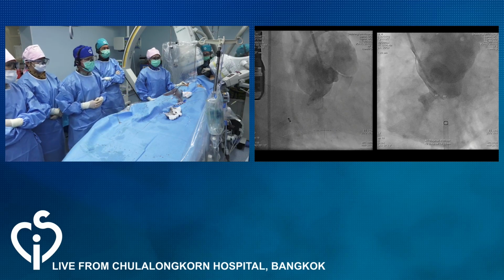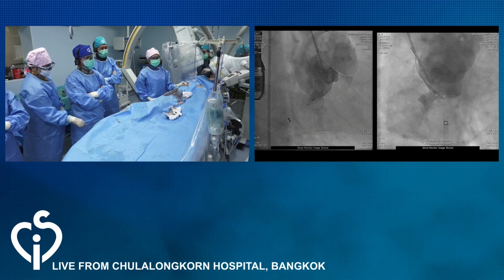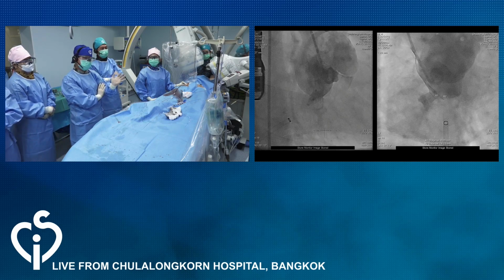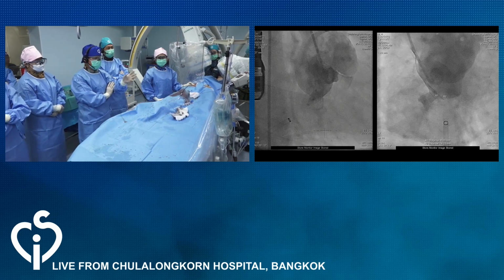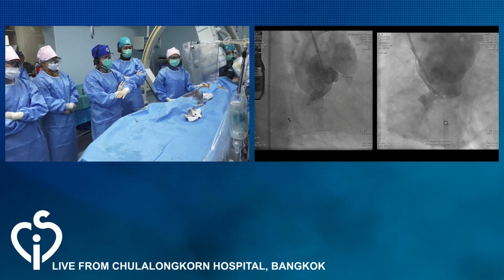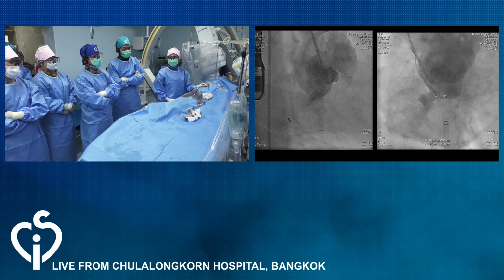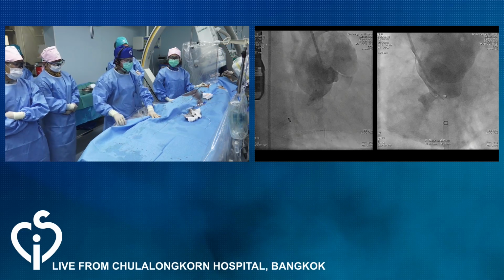It's 6 something. 6.1. Okay. And you can see the diameter of the disc by measurement is 14, but you have to think that the disc is not flattened now, it's concave inside. The original size of the disc is 16, so I think it should be okay. Nearly fully expanded.